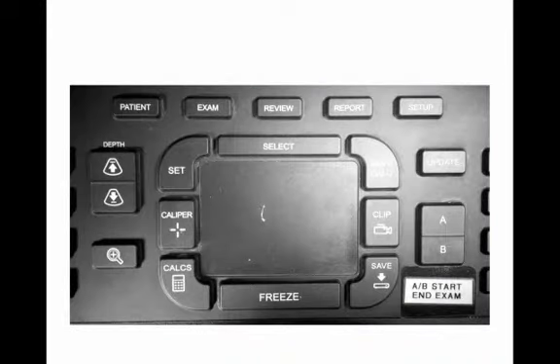Once the curvilinear probe is selected, please set its initial depth to maximum. You can do that by pressing the depth button. You want to increase the initial depth to maximum, about 20 centimeters.